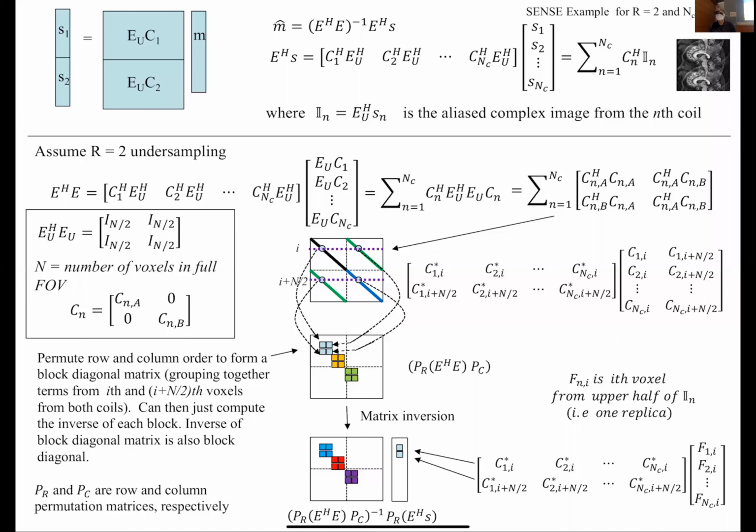It varies a little bit on which scanner you use. For example, if you use a Philips scanner, that will always tend to use something called SENSE. Okay. If you use a GE scanner, it sort of varies. You can do something similar to SENSE, but there's another method which we'll talk about in a little bit, which is called GRAPPA, which is used a little more on, for example, Siemens scanners. But they all have the same principle.